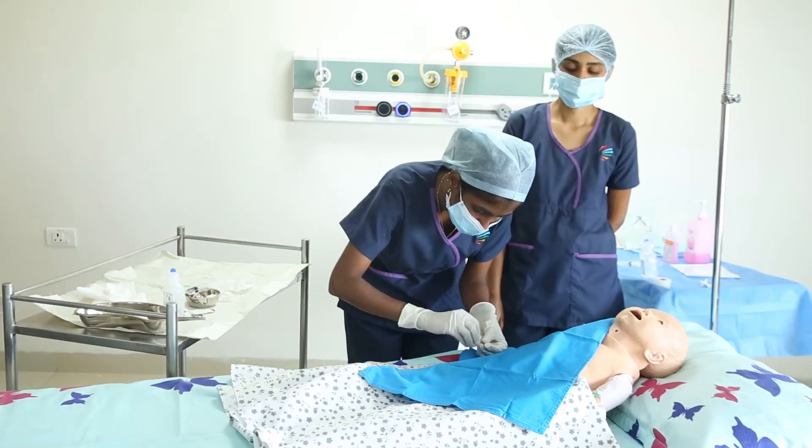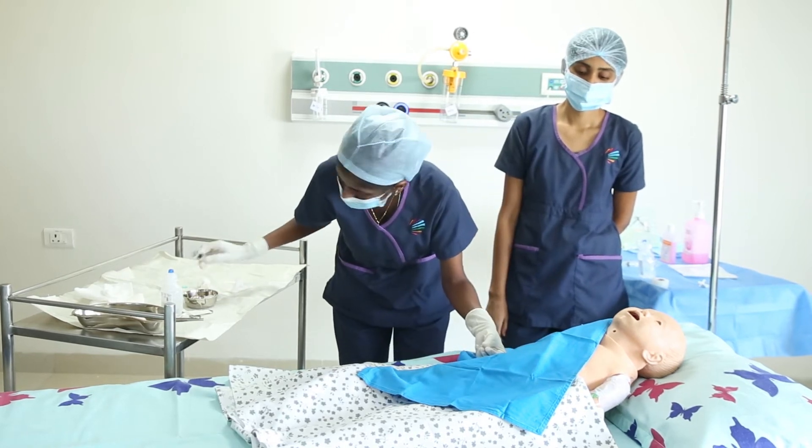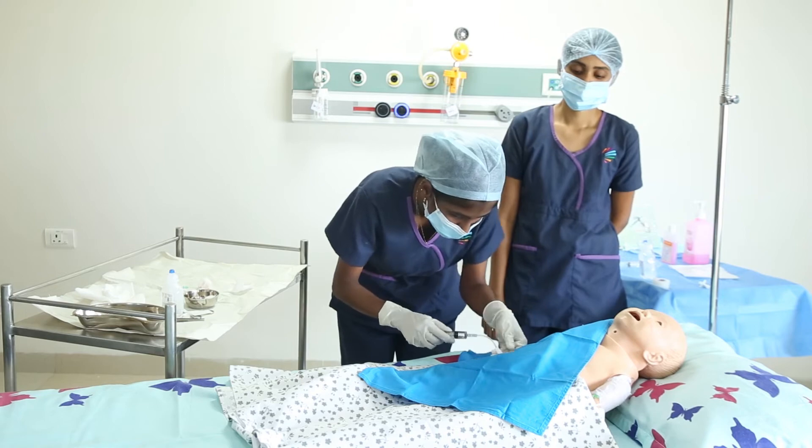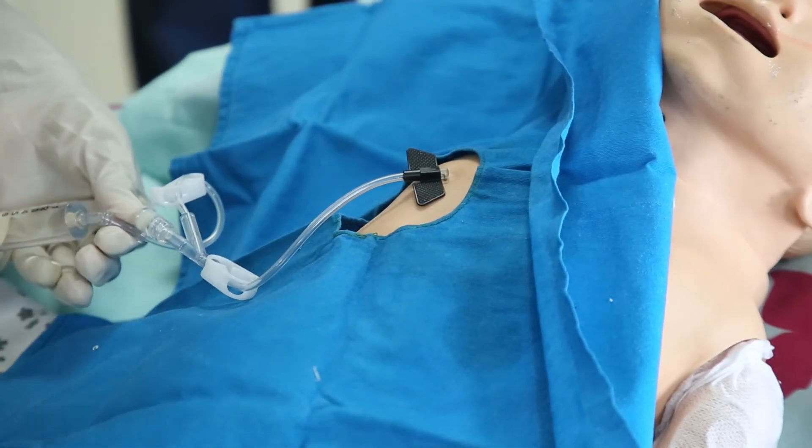Then gently aspirate blood to verify proper placement of the needle and discard the first 2-3 ml of blood. She will then give a proper 10 ml flush and lock the line.